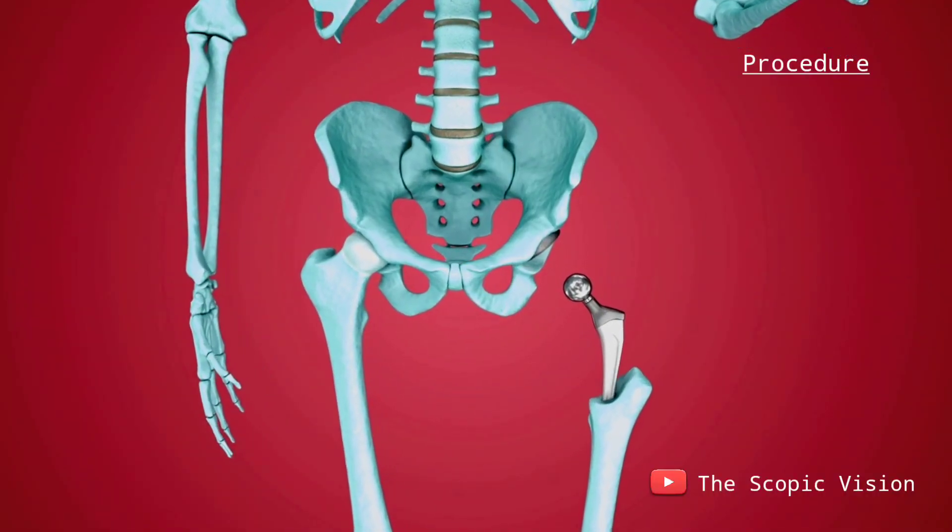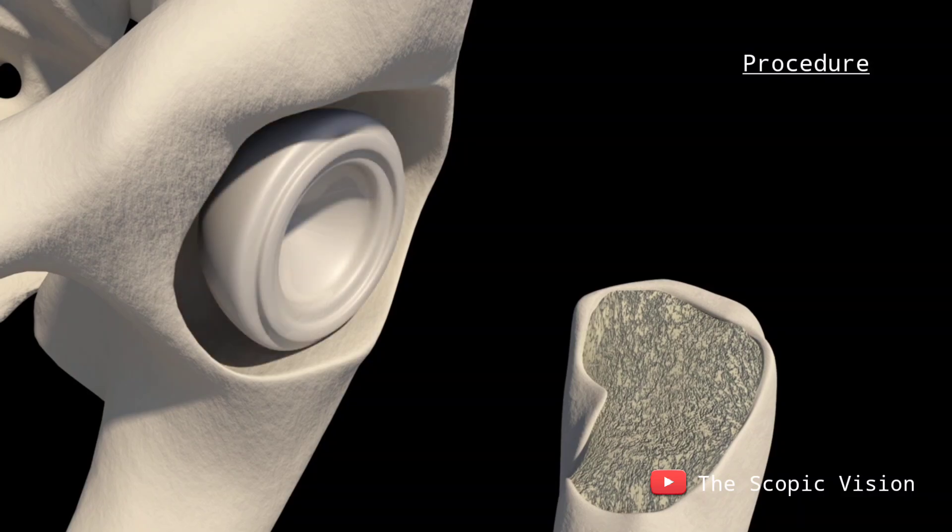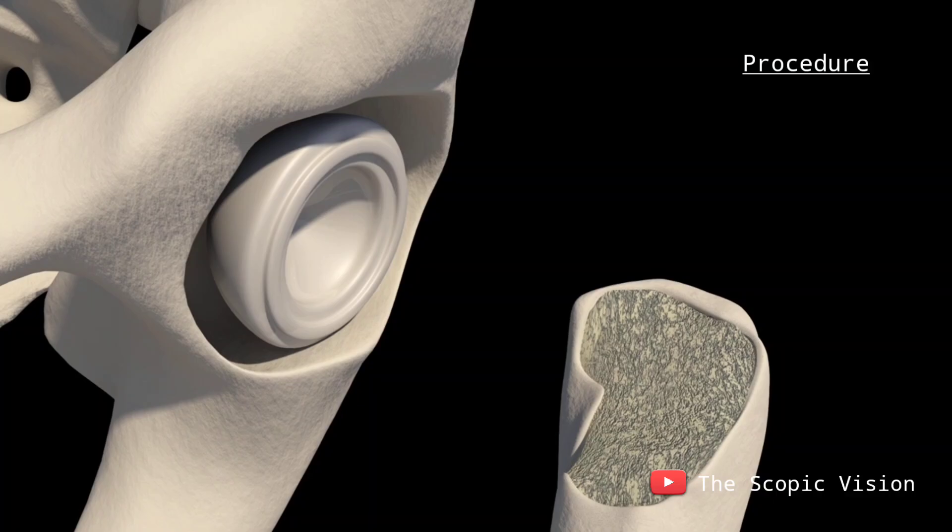Next, they reshape the acetabulum using specialized tools and insert an acetabular prosthesis, typically secured with cement. This prosthesis is designed from a combination of metal and plastic.